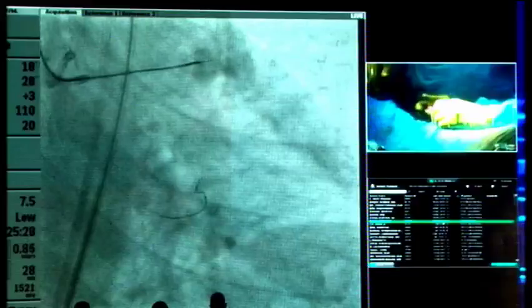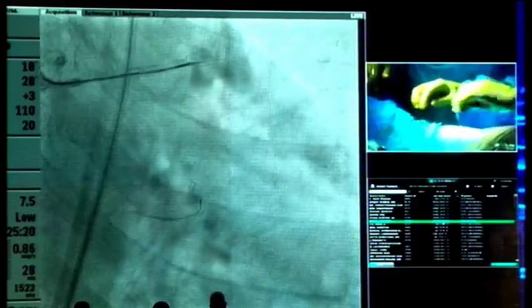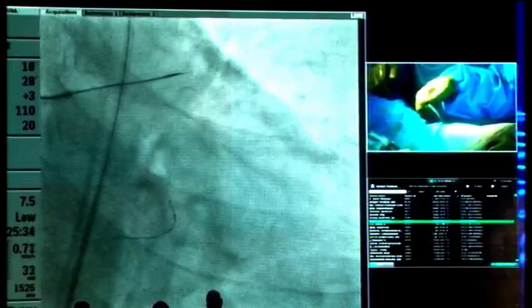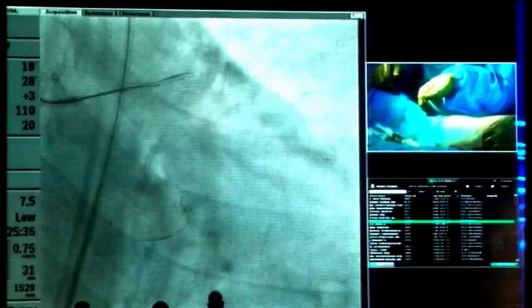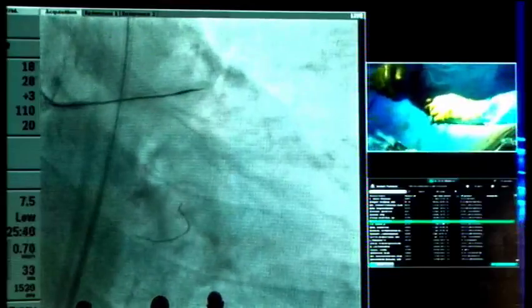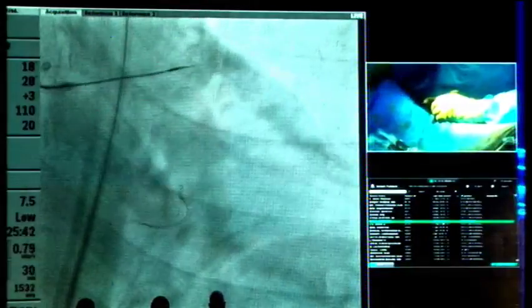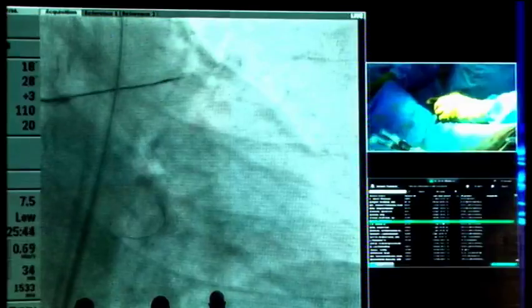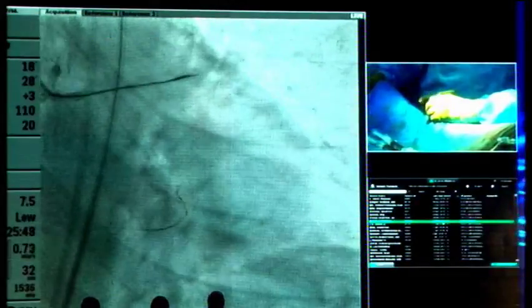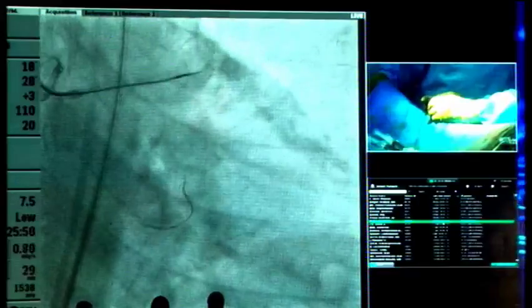Somebody open up the shoulder 3 once again, because the tip is already, yes. New shoulder 3. Yeah, I think the tip is just a moment. The tip is already damaged, I guess. No. Okay.